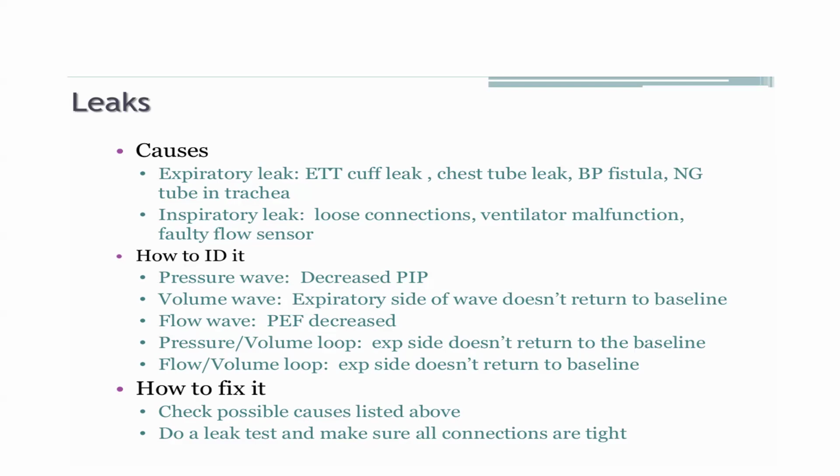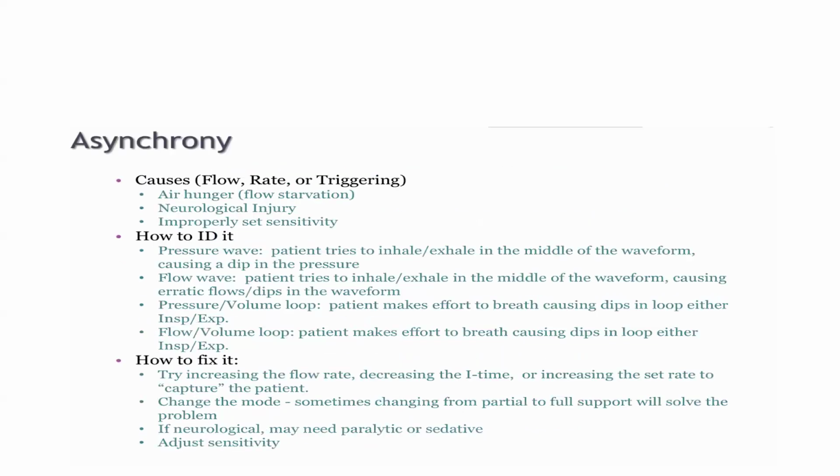Now, how to fix it? Check possible causes and do a leak test and make sure all the connections are tight. Then asynchrony: neurological injury and improperly set sensitivity.